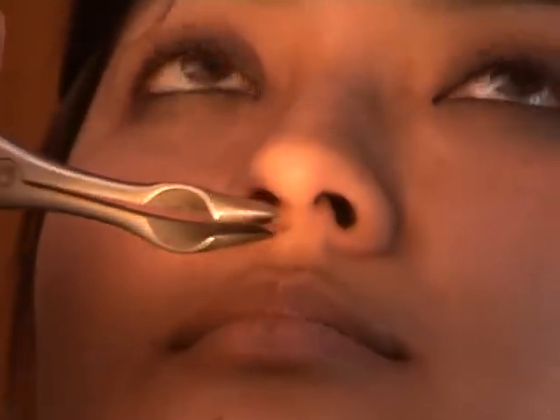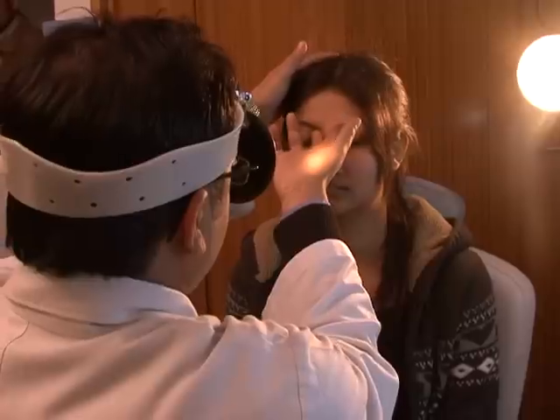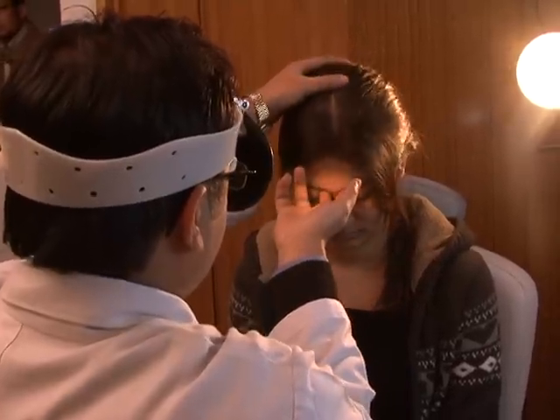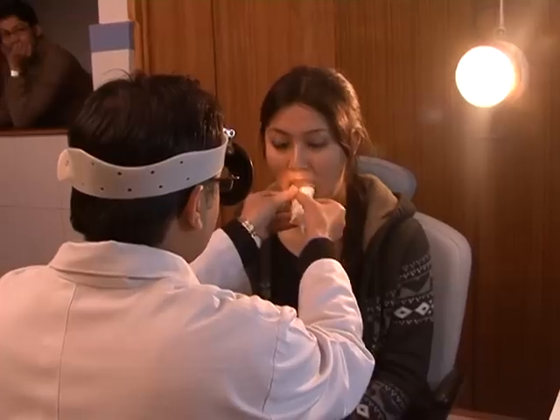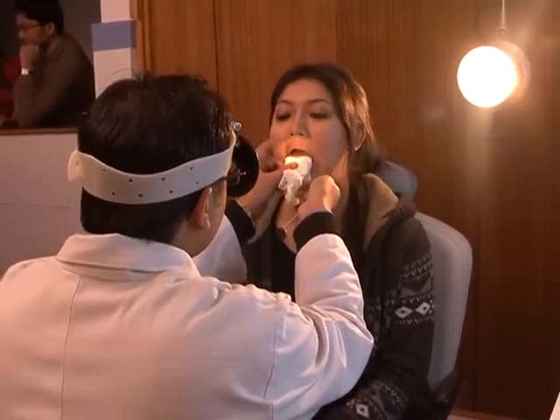If any growth or polyp is suspected, confirm by probe test. Sinus tenderness is examined by putting digital pressure on the supraorbital region, medial canthus region, and below the malar prominence.